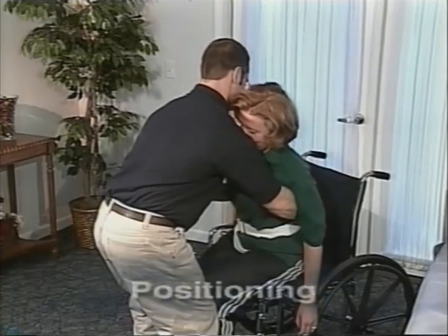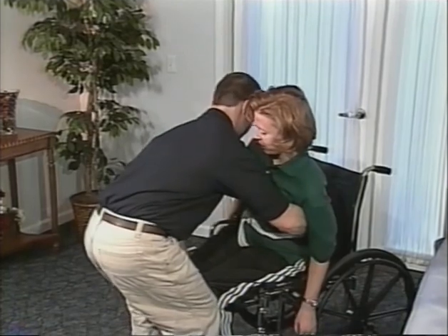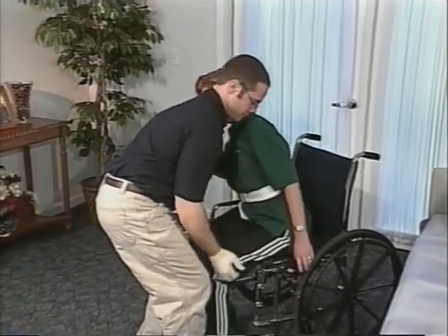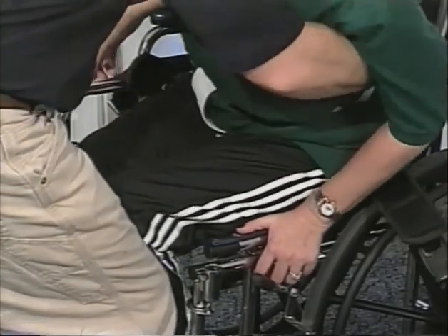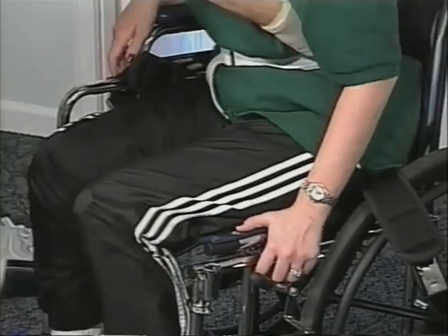Once the transfer is complete, you must position the client in the wheelchair. First, you must scoot them back in the wheelchair. Cradle the client to unweight one hip or use knee-to-knee contact to guide the unweighted hip back in the chair. Repeat side to side until the client is all the way back in the chair.